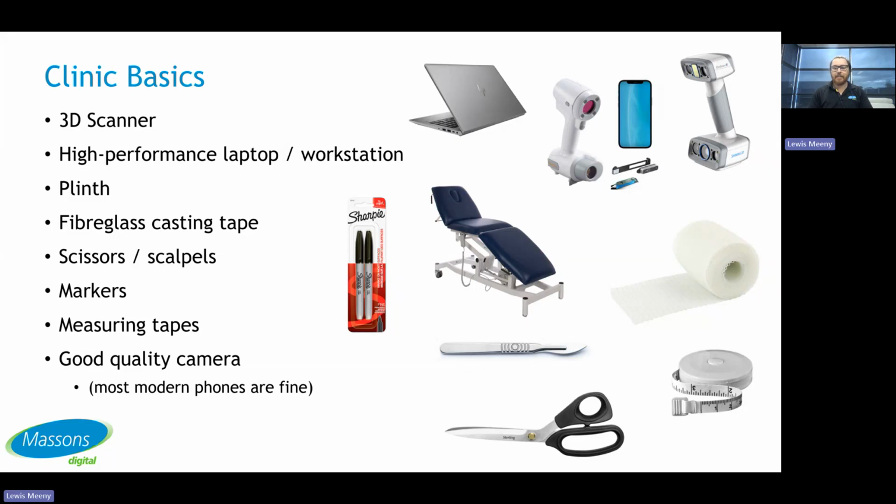You notice that we don't have any plaster here because we are trying to eliminate plaster. So fiberglass casting is fantastic if you're trying to maintain position of a patient, or if potentially you're going remotely and you need to do a bunch of appointments back to back, you can always cast and then bring them back to wherever your scanning setup is for later. We recommend on the bottom here, you can see a good quality camera.